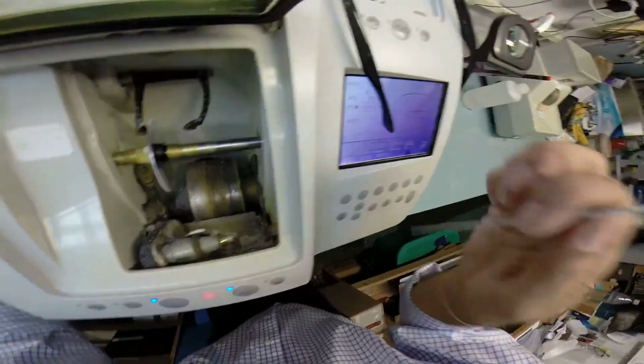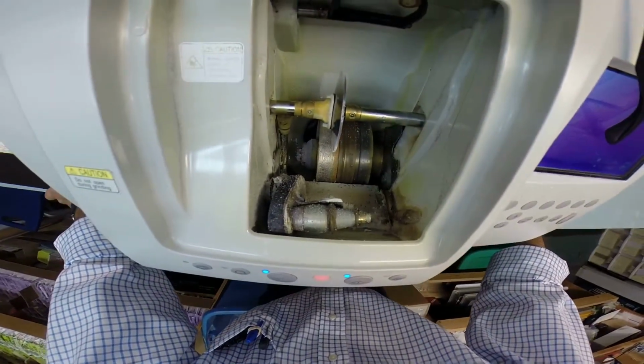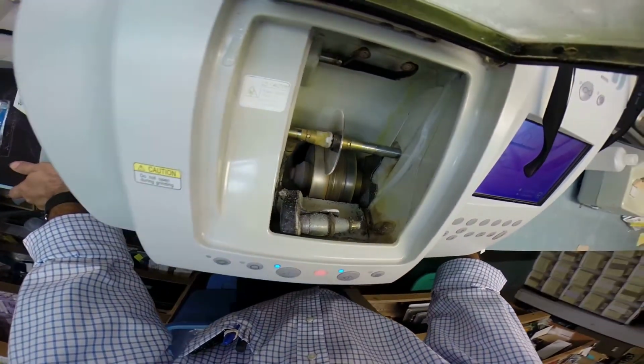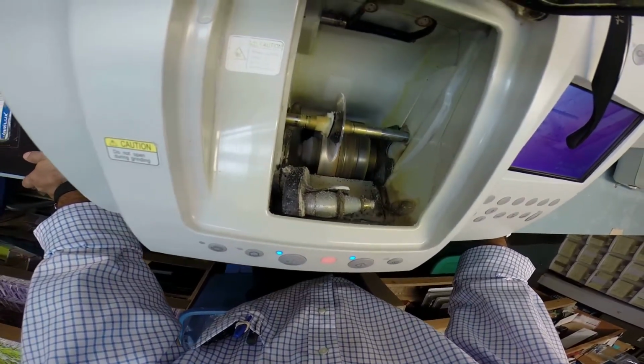The actual cutting wheel is down here on the bottom left. It's that lighter color wheel. It's going to act like a heavy grit sandpaper to grind away your lens material. And then this wheel in the center with that little channel, that little valley, that's what's going to put the bevel onto the lens. Now we'll have to close the door in a moment, but I just want you to see as your prescription lens touches down on the cutting wheel.